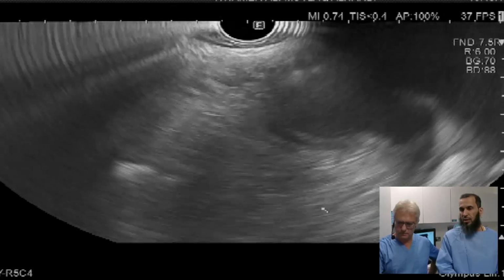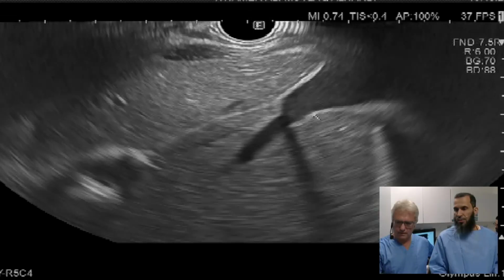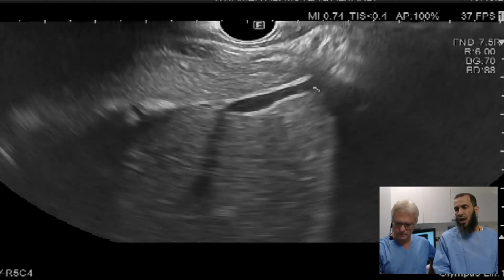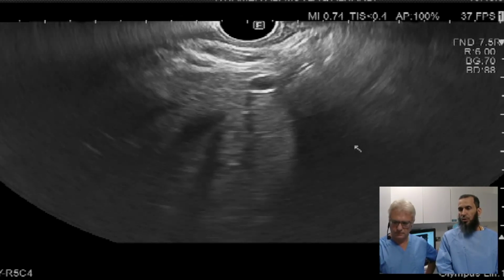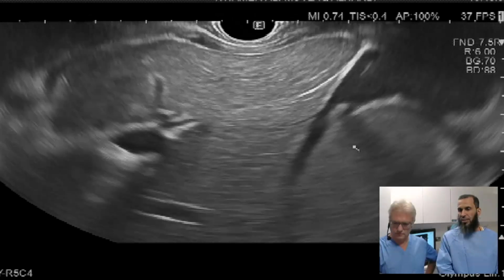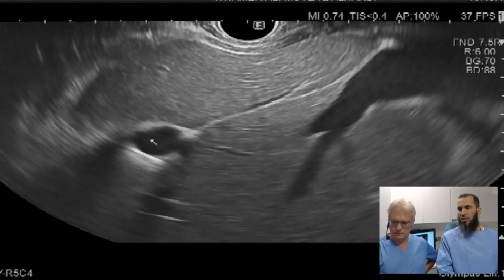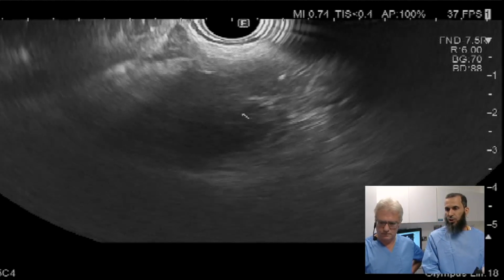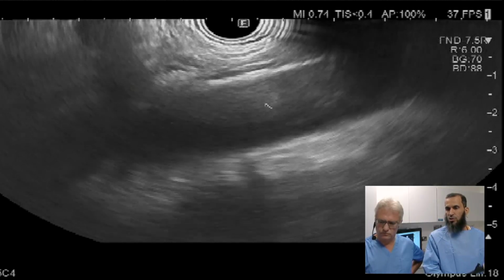As you see, this is a landmark. So the first landmark for EUS here, we have to see the liver. So this is the very wide IVC, as you see crossing in the liver, very compressible. And once you turn clockwise, you're seeing the portal vein there, very clear portal vein, as well with hyperechoic wall. Then more clockwise, you see the aorta. This is the aorta. I have to push in a little bit. I have to keep it in the center to see the landmark.